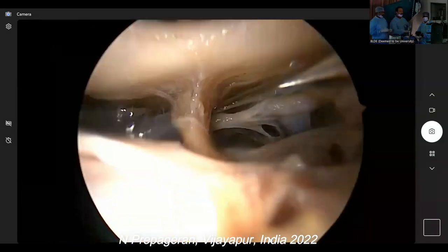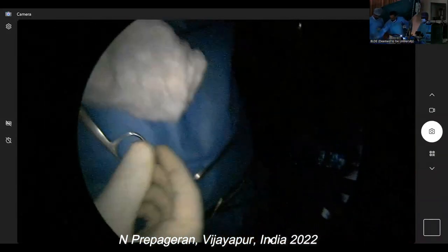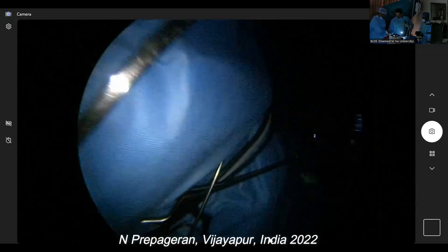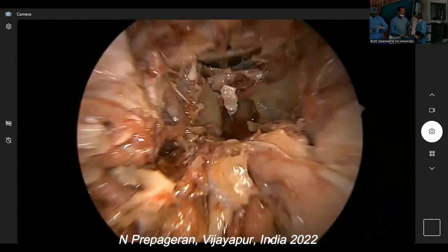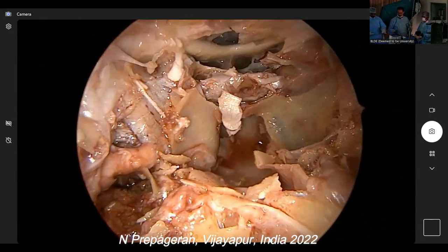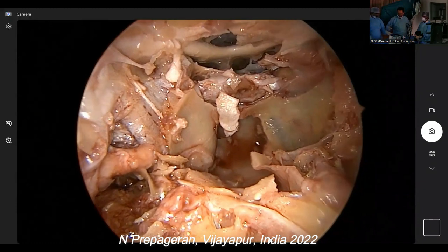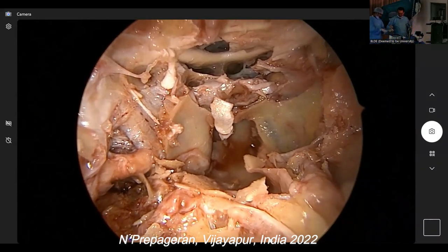Okay. Now you have removed the tumor, correct? Can you cut this for me, a small tiny piece? So how do we reconstruct now? Surgery done. Time to go home. Boys waiting for pizza. It's too big. Ah, smaller, smaller. So how do you reconstruct?